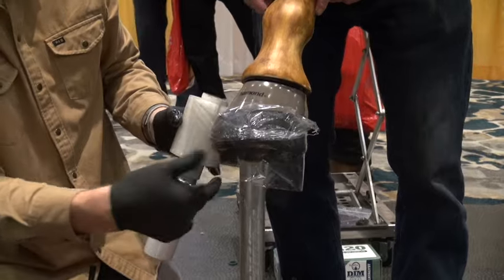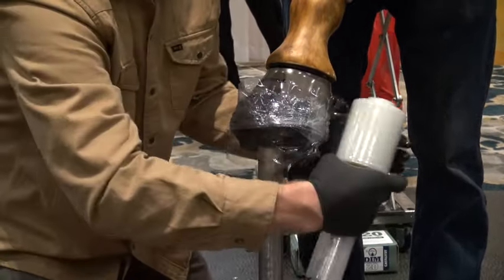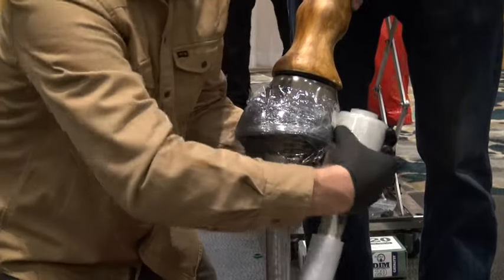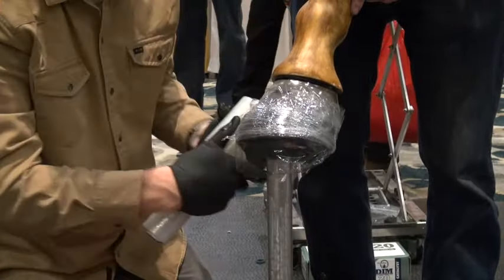Don't wrap the hoof stand in with the foot — I've done that before and it's turned into a disaster. Horses don't like foot stands attached to their feet when they're set back. It's like a rodeo.